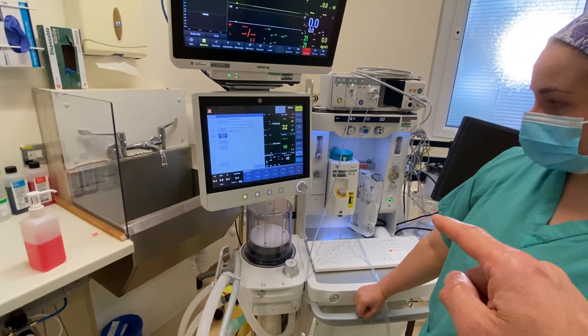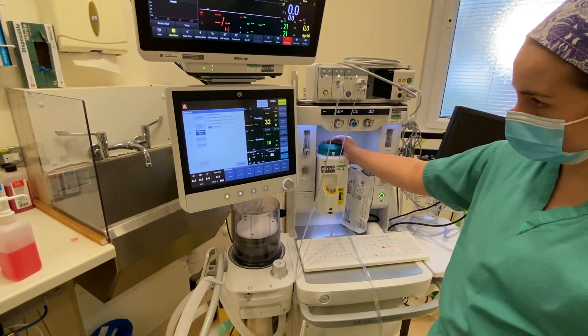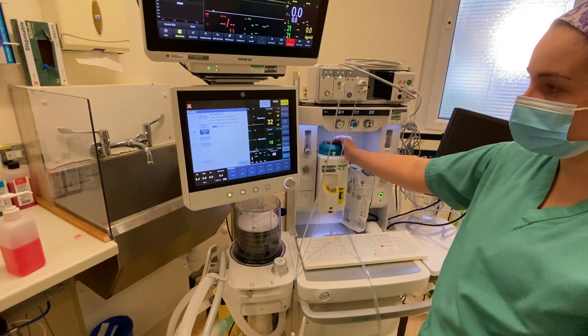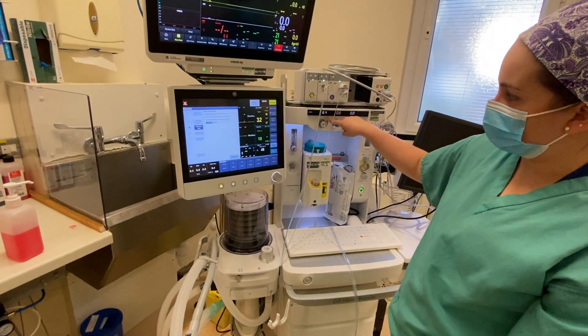Do you turn it on on a certain number? It doesn't matter, just as long as it's on and open. And you can see it's testing that you can still flush through with oxygen here.